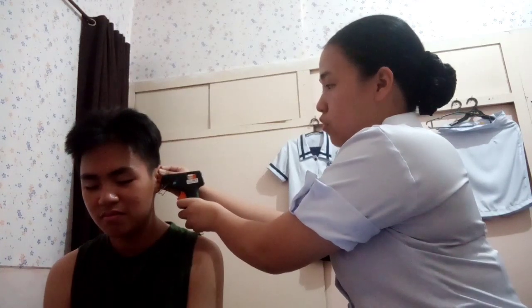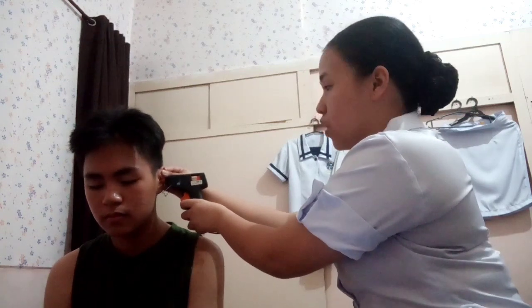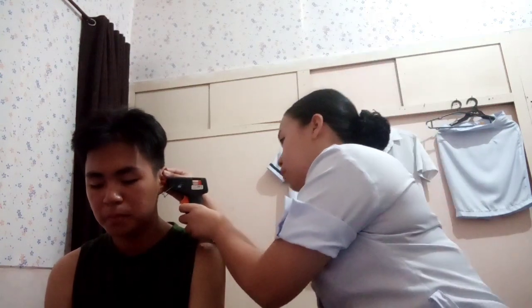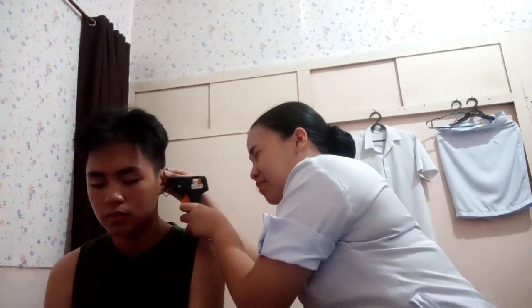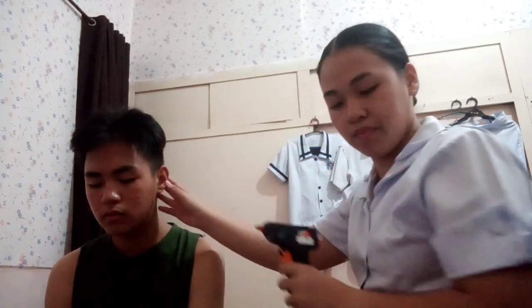So I'm going to note the consistency of the cerumen, and I'm going to observe the color of the cerumen that I am looking at. So then I'm going to continue doing that and I'm going to inspect the tympanic membrane or the eardrum, and I'm going to note the color and the shape of the eardrum and look if there are any abnormalities.